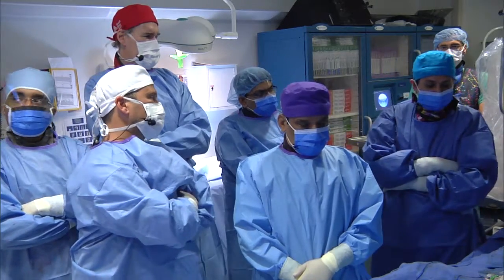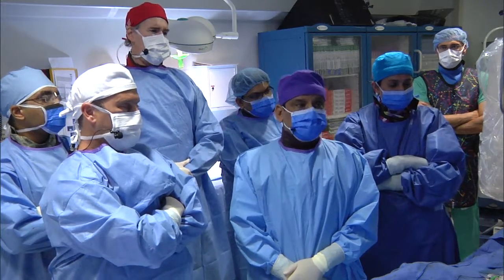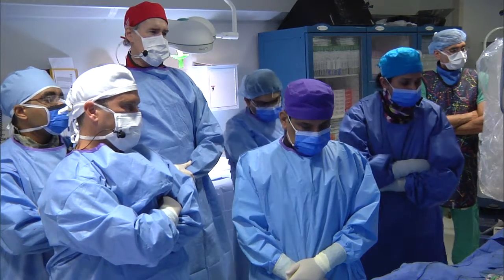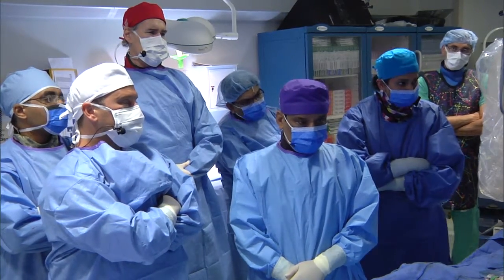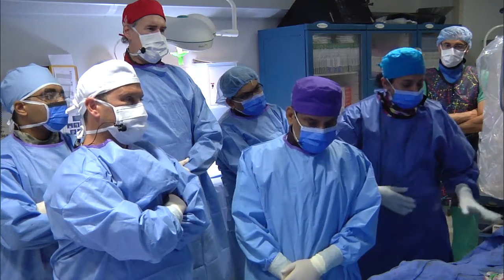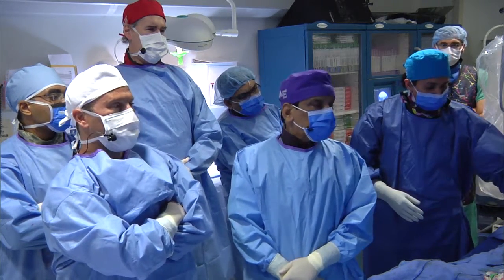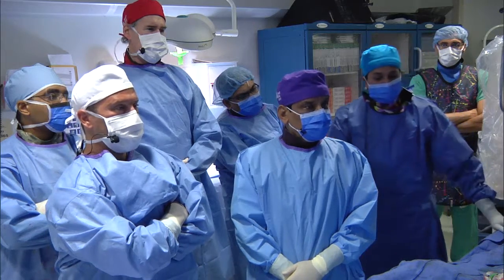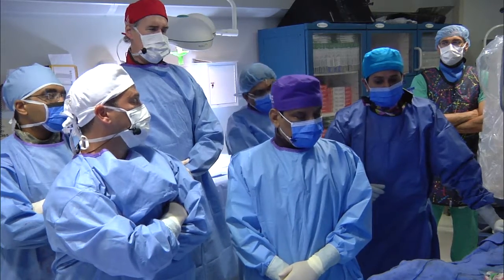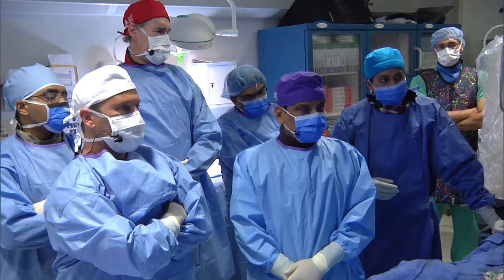If the patient has had a recent BAV in the last couple of months, I think ideally, no matter how tight it is, we would just go ahead and place a valve directly. But usually, if we have an echocardiographer in the room, they will tell us how tight the valve is, and that can help us. The echo can help us to say, is it okay that we just go ahead and place a valve, versus we have to do a BAV. That BAV would be with a 20 millimeter balloon, so that we will be able to get the valve across the native aortic valve easily.